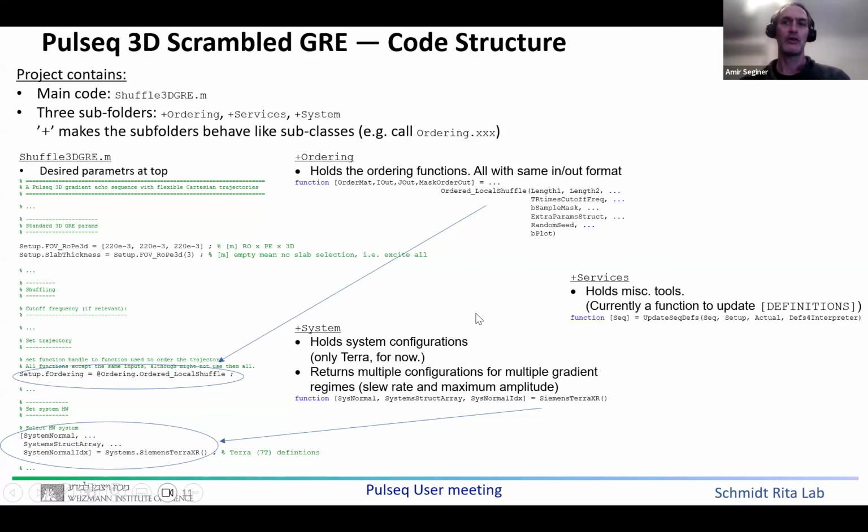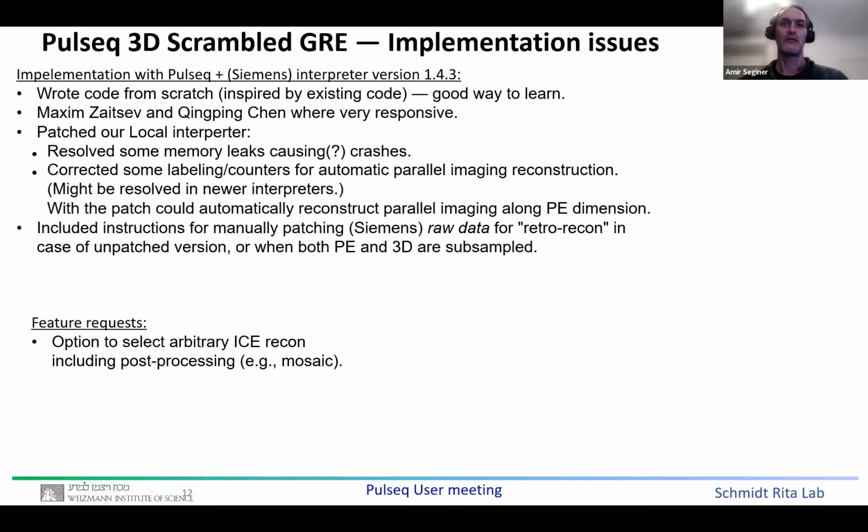As I mentioned earlier, we wrote the code almost from scratch, which was a good way to learn. We developed this for Pulseq version 1.4.3. We had some issues on the way, and I must say Professor Zaitsev and his team, Dr. Chen, were very responsive.